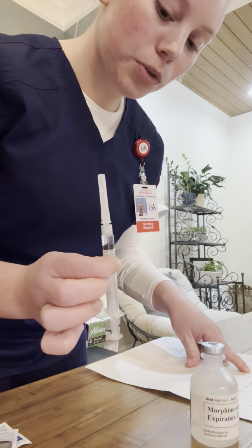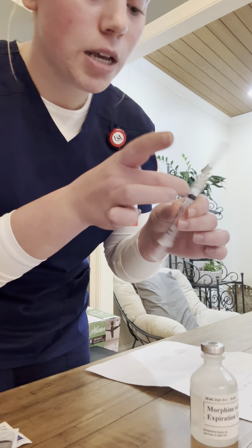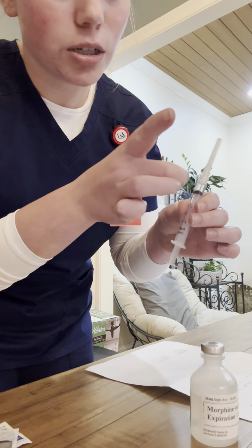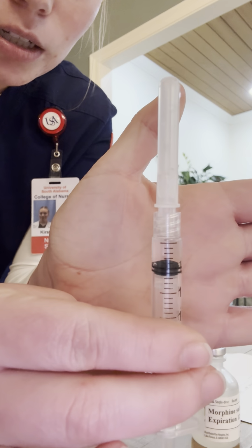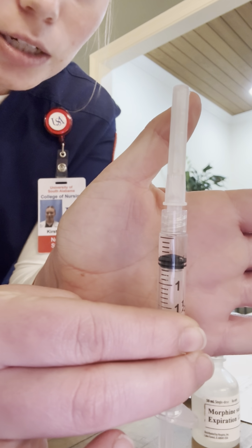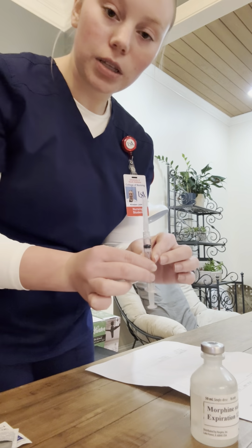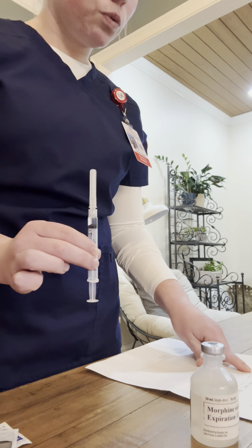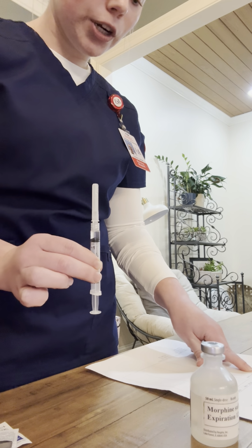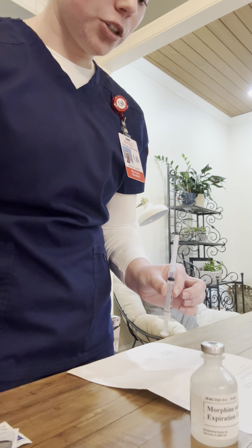And now I'm going to verify this with another nurse because this is a high-risk drug. This is morphine. So I would check my correct dose. This is 0.5 milliliters. And I would verify this with another nurse. And then now my right route is intramuscular. So I'm going to select the correct needle for an intramuscular injection.